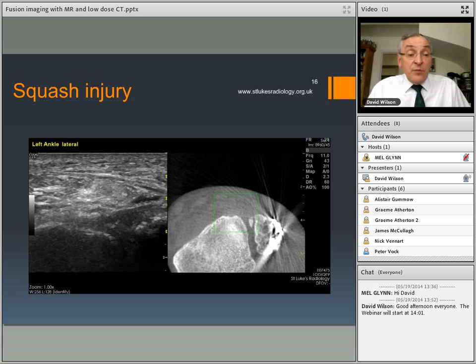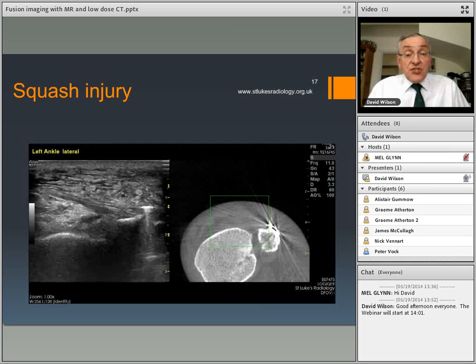But when we ask the patient to move his ankle up and down, then things changed. So this is with the foot dorsiflexed, and those of you that know the mechanics will realize that actually puts pressure on the tibia and fibula and pushes them apart. And here we can see on the CT, that's a previous image, clearly we hadn't all taken at the time, so it's exactly the same alignment, but the fibula has now moved anteriorly on the ultrasound.